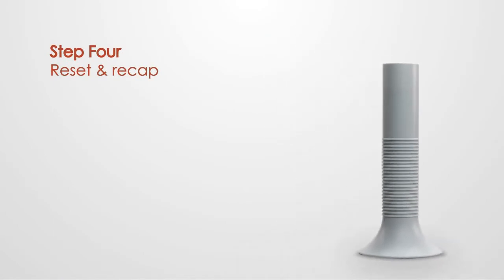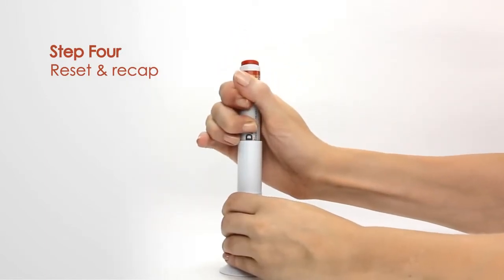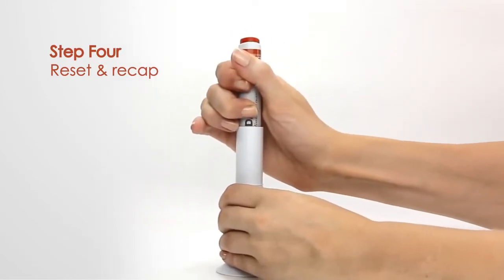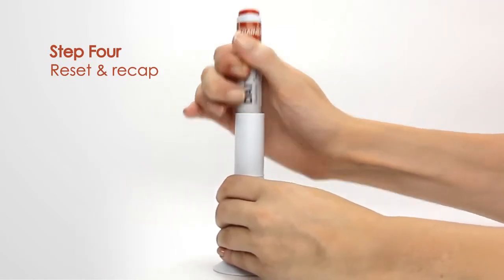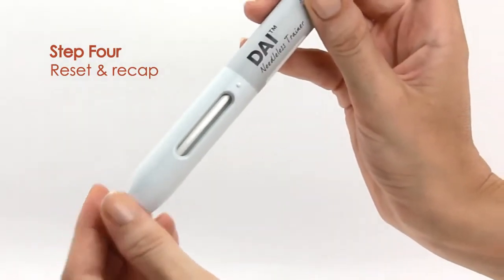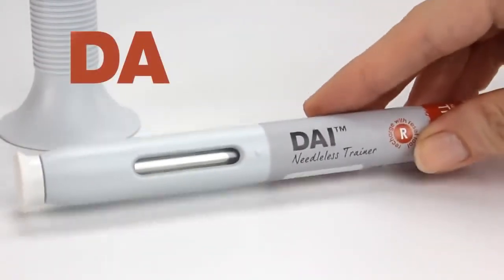Step 4: To reset the training device, use the reset tool that comes with your demo pack. Push the dye training unit into the open end of the reset tool until it comes to a stop. You will hear a click. Remove the device and recap.